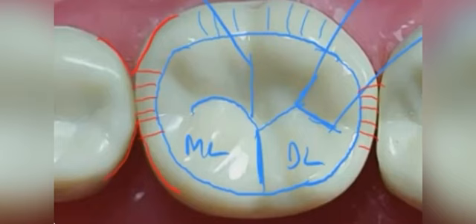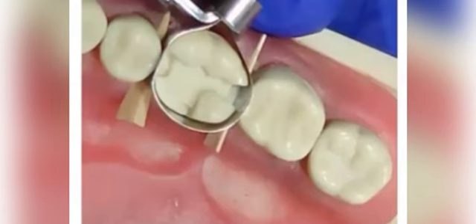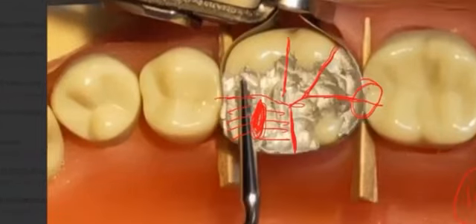Mesially, you can see it will have the contact which is the V shape, and the cusp is also having the curvature. So you need to create the same anatomy you can see in the clinical picture. So the kind of cavity you are getting is displayed over here. Double check the contact has been removed while you create the anatomy, and when you use the amalgam it should create the same.